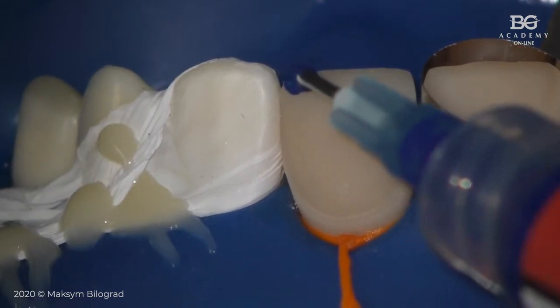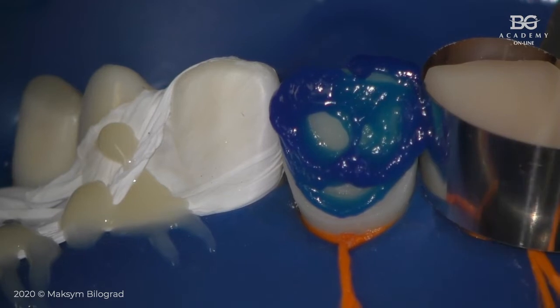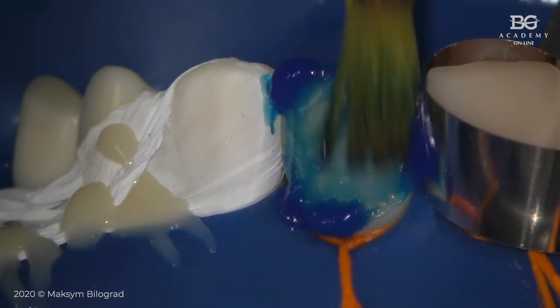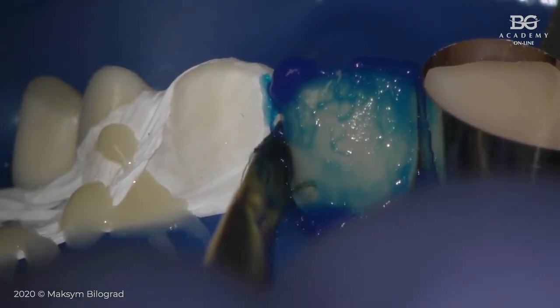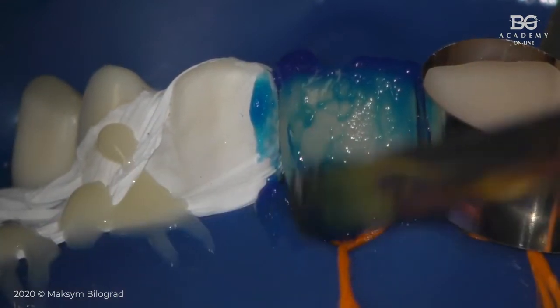So we just take phosphoric acid. Okay, we put phosphoric acid all over enamel. I also really like to work with this type of brushes. Why I like to work with this type of brushes? Because I can go between teeth like this, gently, because I have to prepare that enamel also with phosphoric acid.